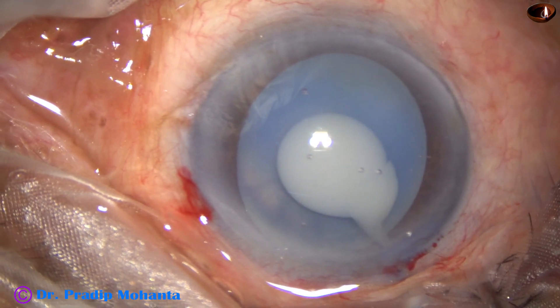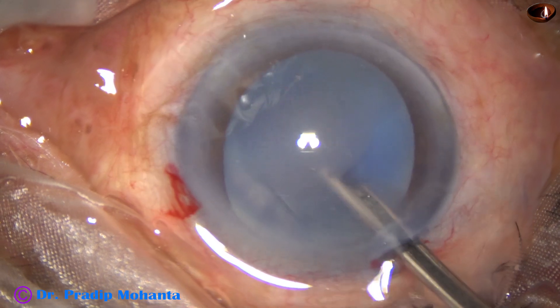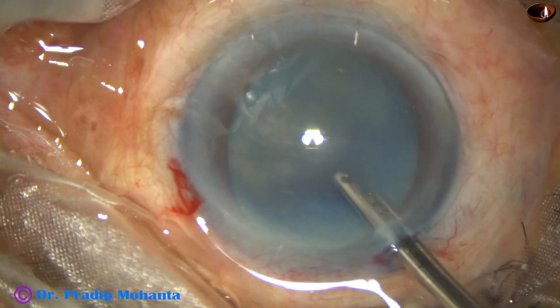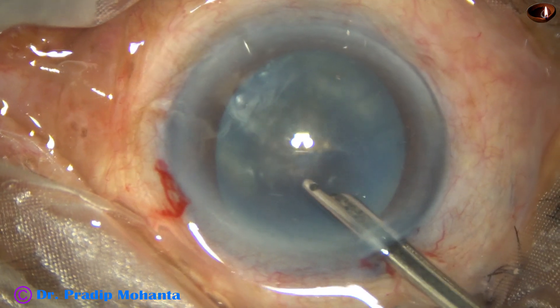Milky fluid comes out and the milky fluid is aspirated — in hypermature Morgagnian cataracts this can be done. We need not do a mini-rhexis. The flap doesn't extend to the periphery.